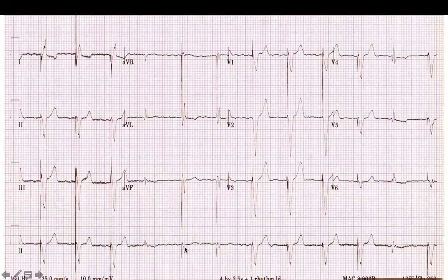Paced again. But now the QRS is a little bit different. Yes. And if you look at the QRS here, it's mostly positive. And if you look at the QRS here, there is a small r and then an S. Right? Yes. In the negative as well. So it doesn't look exactly like the intrinsic and doesn't look exactly like the paced one. So what do we call this one? Improper pacing or not delivered pace. So there is a pacing spike, and it's not totally wide, but it's not totally normal. So it's a fusion between the native QRS and the pacing spike, or the captured ventricular.